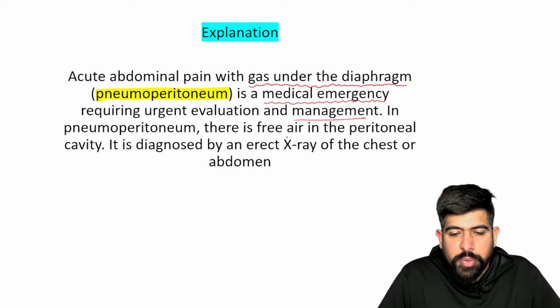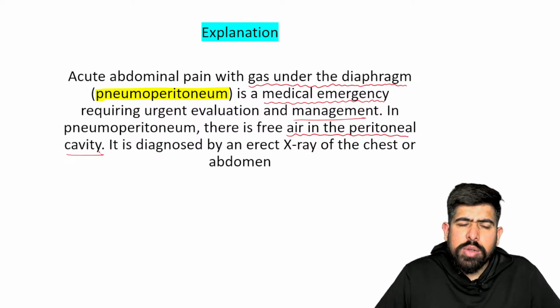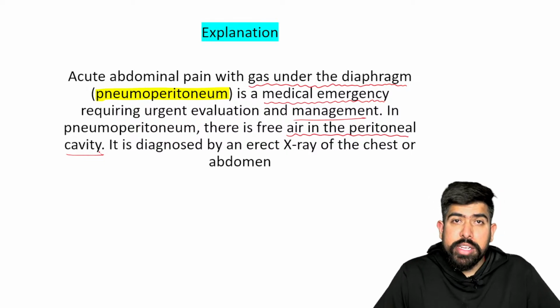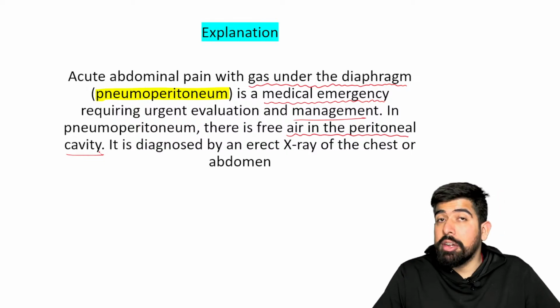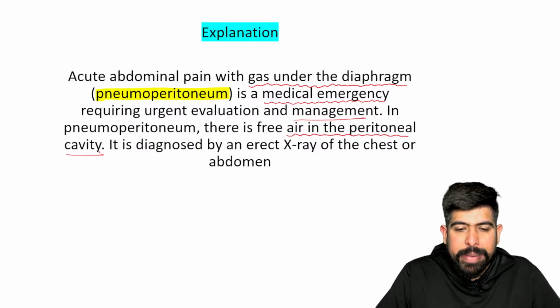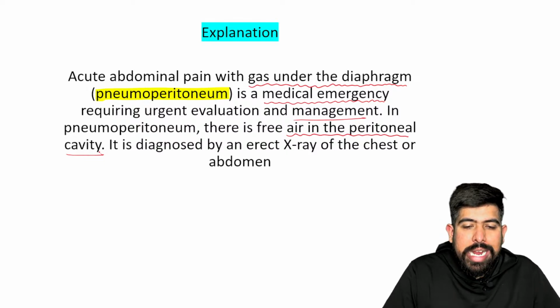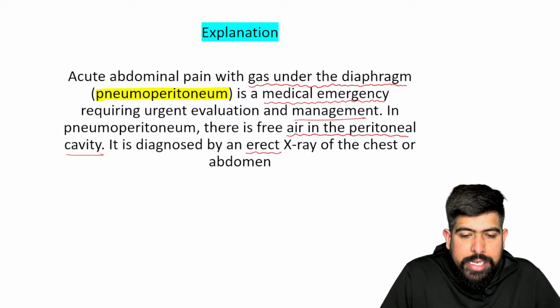Please remember there is free air in the peritoneal cavity, right? And we have to diagnose how the air got there. Maybe there is some intestinal perforation. So we have to diagnose this, and this is your medical emergency. And please remember, we diagnose this patient with the erect X-ray, so we can do the erect X-ray also.